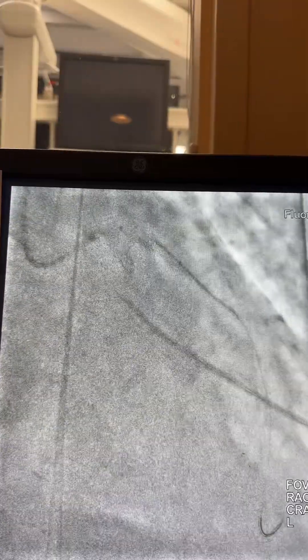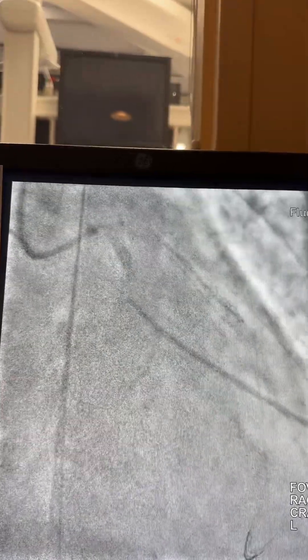Here I'm using a 3.0x38mm stent and inflating it at high pressure. Then there's another segment — another 3.0mm stent as well.